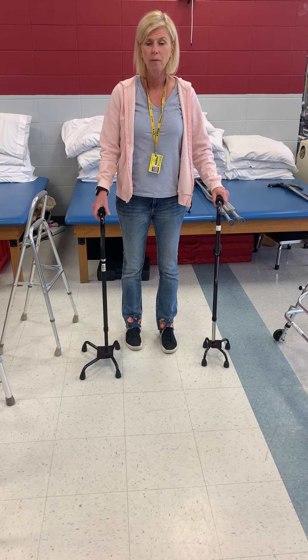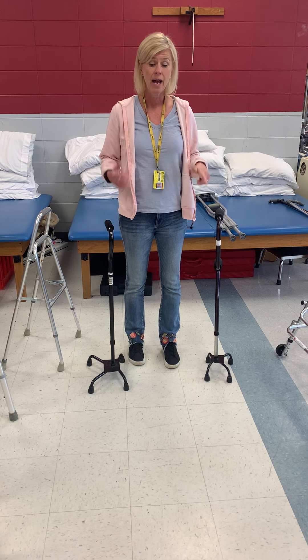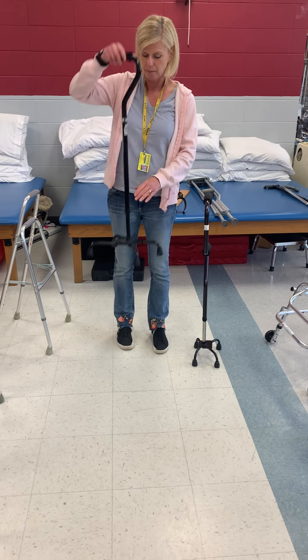Some people really want them, and what I do is if they say they really think they need a quad cane, I'll take a quad cane and a straight-line cane and we'll practice with both. Usually very quickly they say they'd rather just have the straight-line cane.